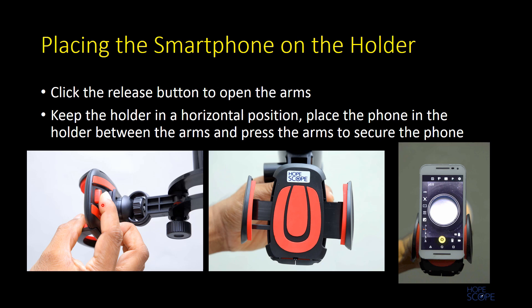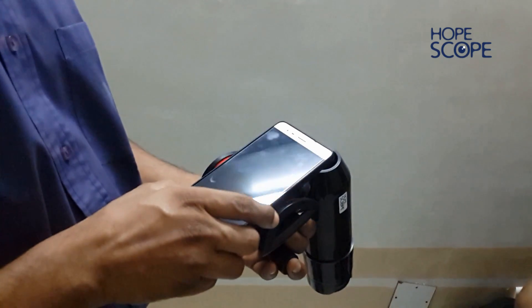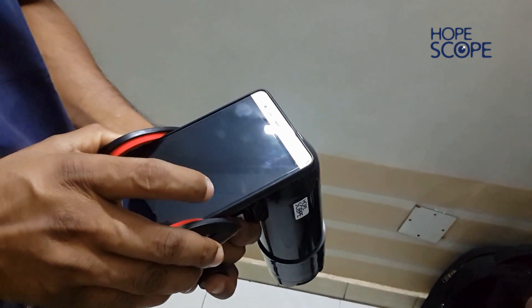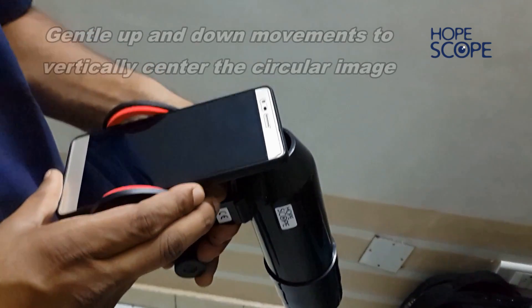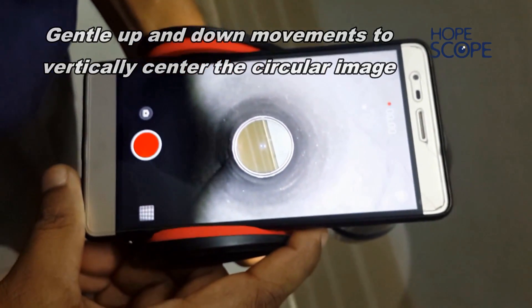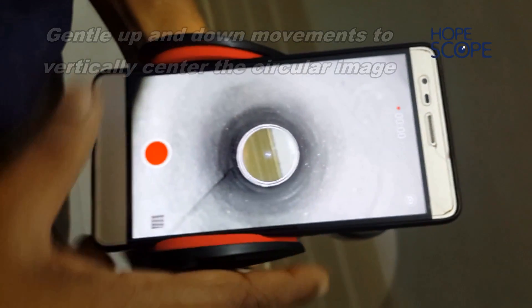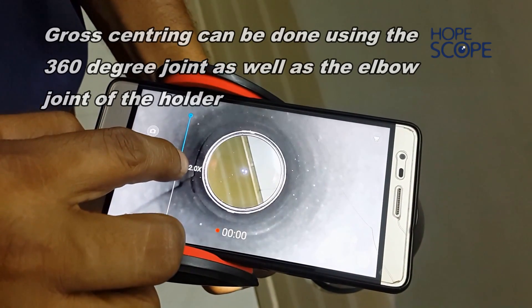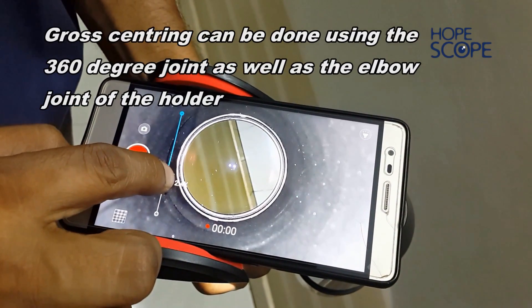On the holder there is a release button. When you press the release button firmly, it opens the arms. Then keep the holder in a horizontal position and place the phone in the holder between the arms and press the arms to secure the phone. Make sure the phone is well secured. With gentle up and down movements one can vertically center the circular image. Gross centering can be done using the 360 degree joint as well as the elbow joint of the holder.